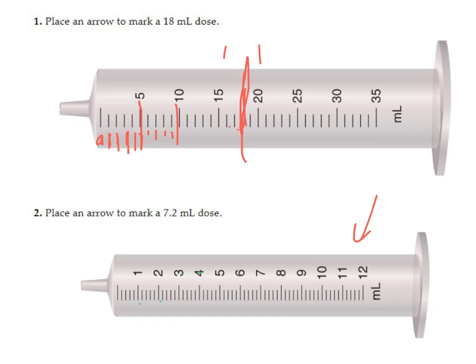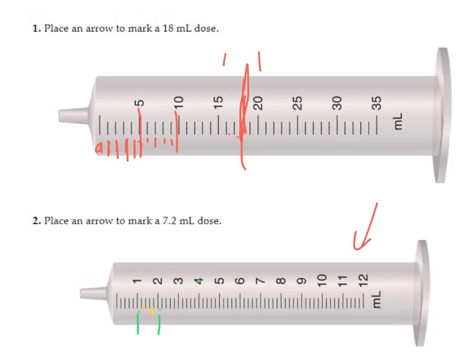So think evenly. I wouldn't count between 1 and 2, for instance. So here's 1 and here's 2. Between 1 and 2, I wouldn't call this 1.1, 1.2, 1.3, 1.4. That's because this would have to then be 1.5. And it's not. It's 2. So therefore, we're going to count this off in 2/10, in decimal. We're going to count it off in 0.2s.